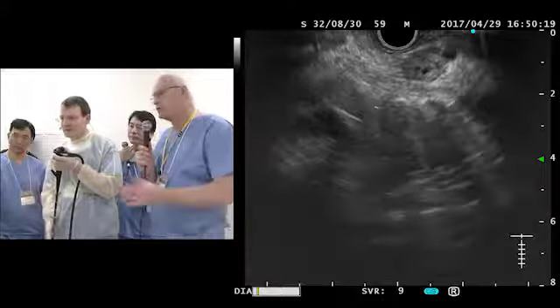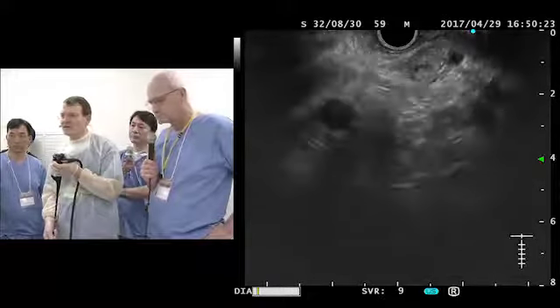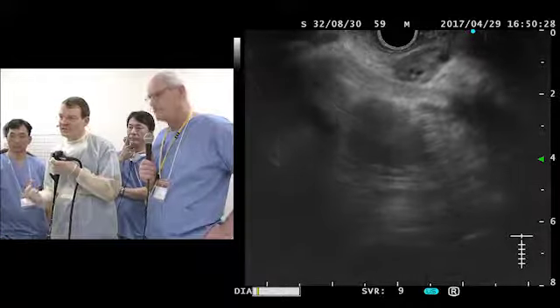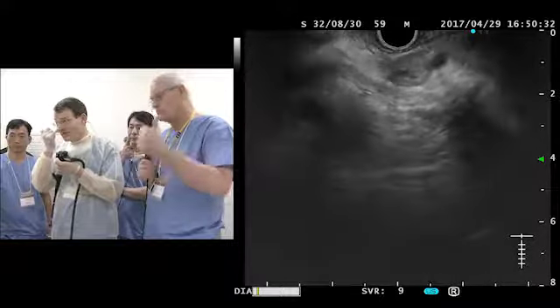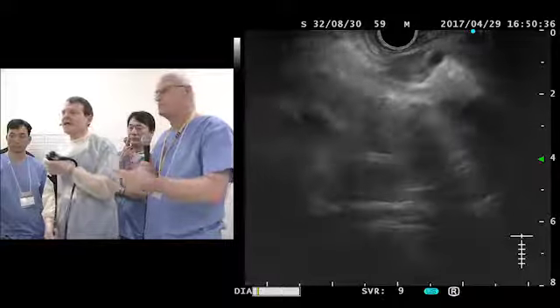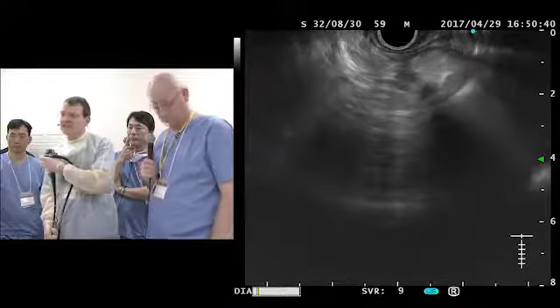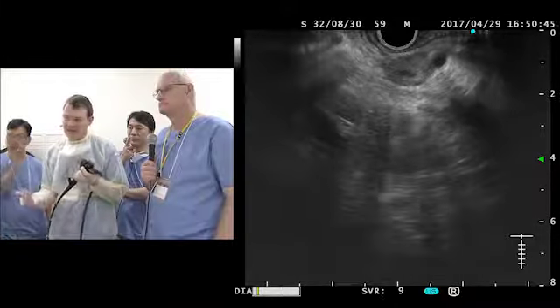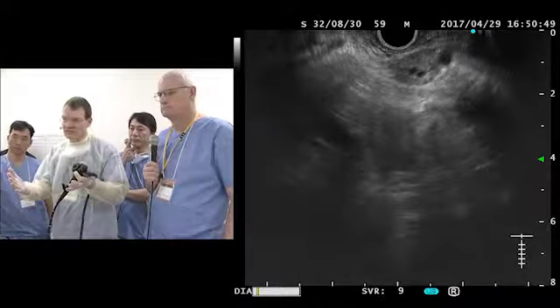Yes, please. Exactly. So I think this is a patient who definitely needs surgery. We have a suspicious cystic lesion with thick septa. We have a dilated pancreatic duct. We have a history of pancreatitis. And we have a compression of the pancreatic duct here in the tail. So I suppose there is no need for performing EUS-FNA because we have enough signs for the further treatment strategy.